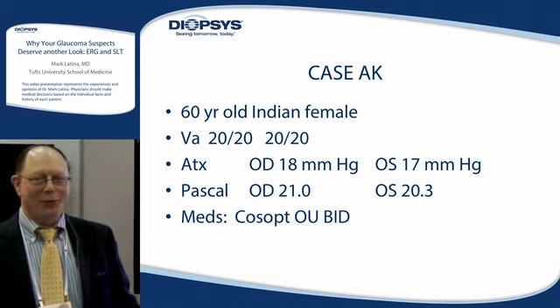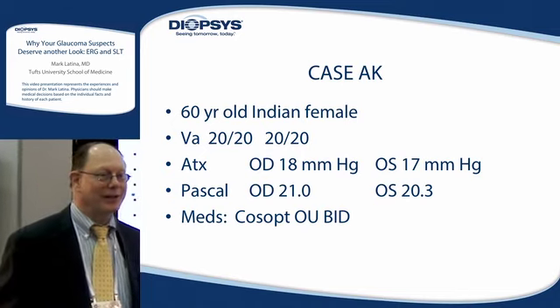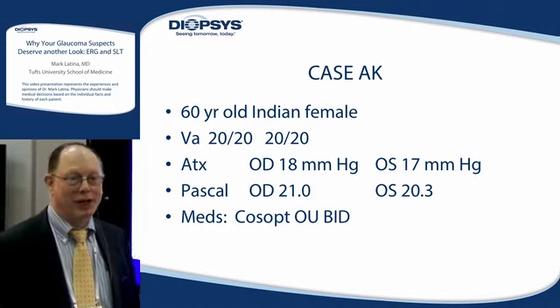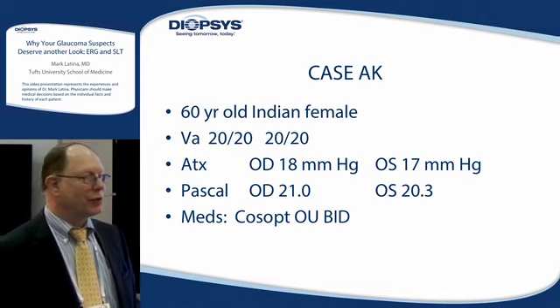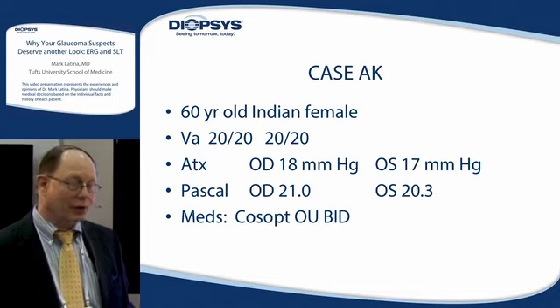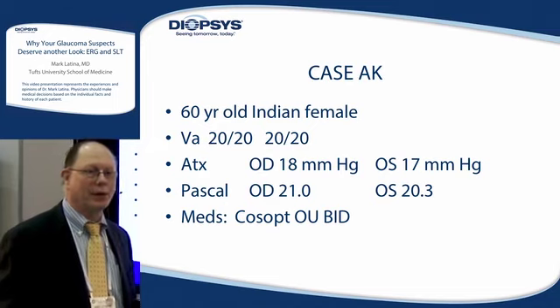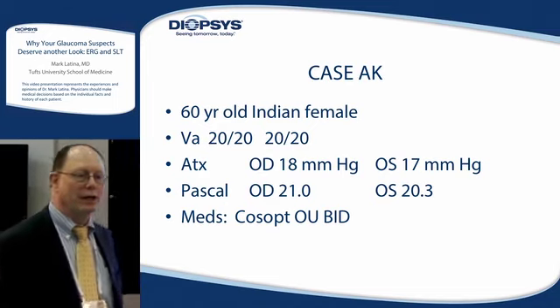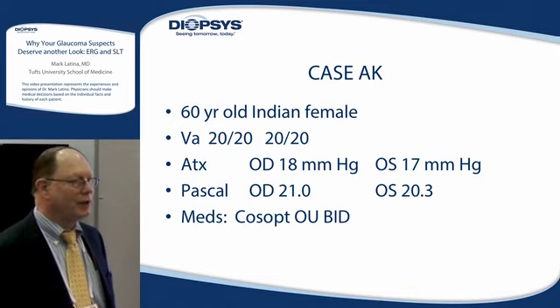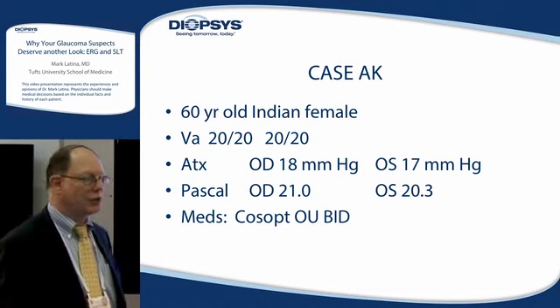It's not been widely used by ophthalmologists, but the pressures measured by the Pascal are probably closer to the manometric pressure than applanation. The influence of corneal thickness on the pressure is not as important in Pascal tonometry as it is in Goldmann. So it's giving you a different pressure measurement, but potentially a more accurate one. We do this especially in our patients with glaucoma suspects and low tension glaucoma patients.